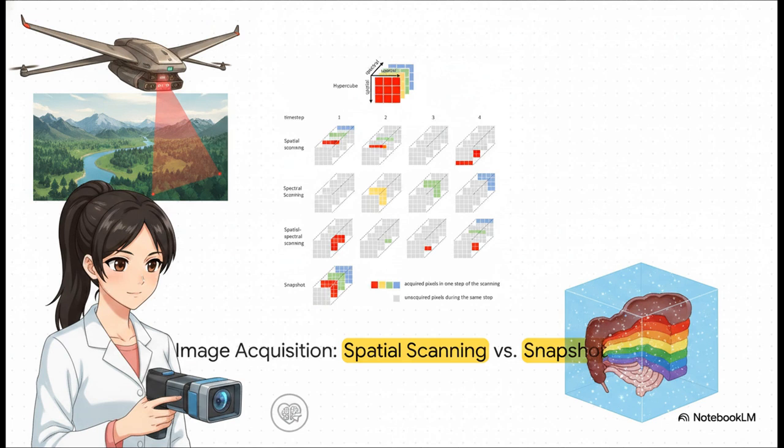Contrast that with snapshot imaging. Thanks to modern miniaturization, we can now grab that entire 3D hypercube in a single exposure without moving the camera at all. And let me tell you, this is revolutionizing handheld and real-time medical applications.